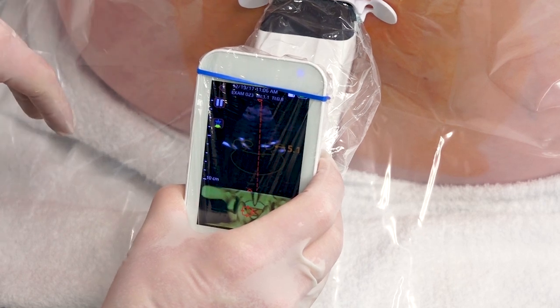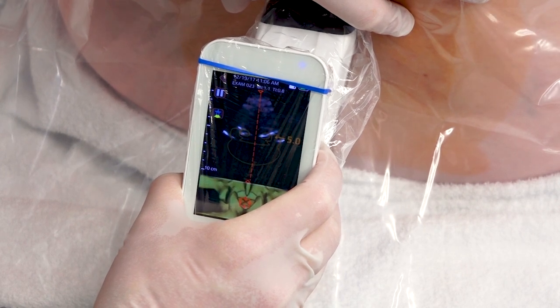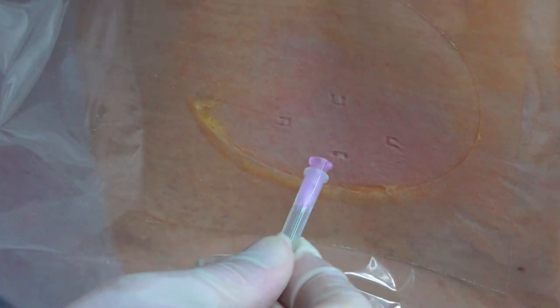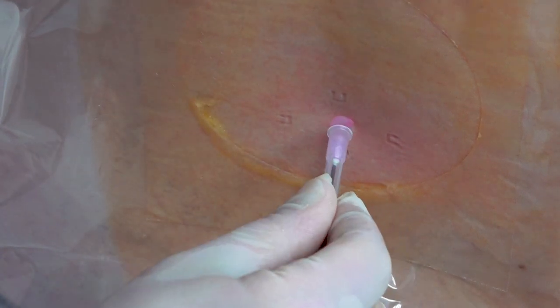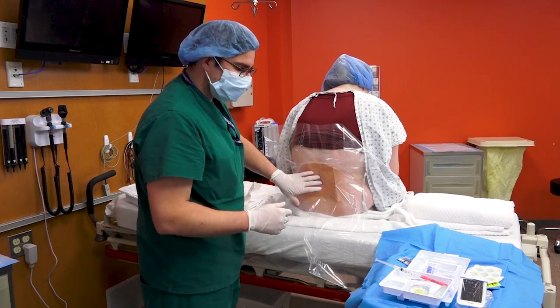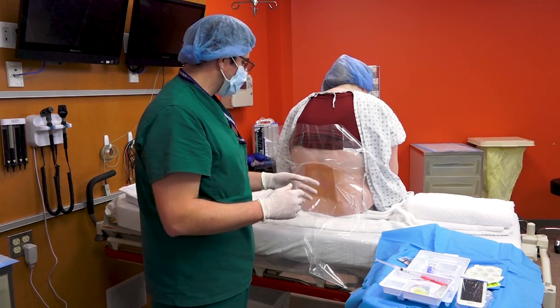Acuro has made it very easy to mark your interspace. Make sure that you're aligned in the interspace, that there are no spinous process visible in the 2D image, and just press on the wings of the Acuro needle locator. That will leave indentations in the skin of the patient to guide you to your interspace. What I normally do is connect this dot with this dot — somewhere around there is going to be my entry point.